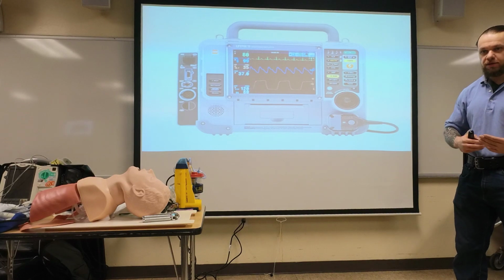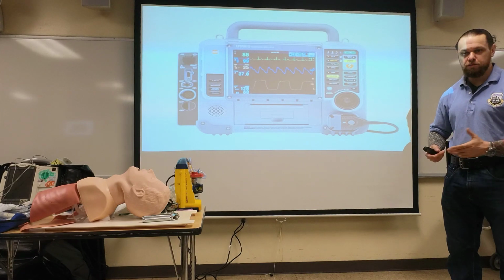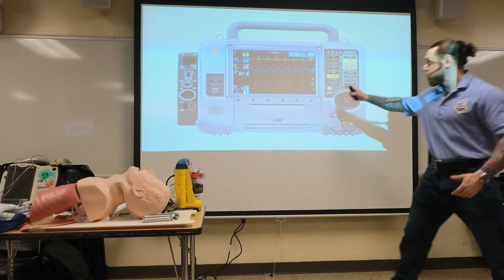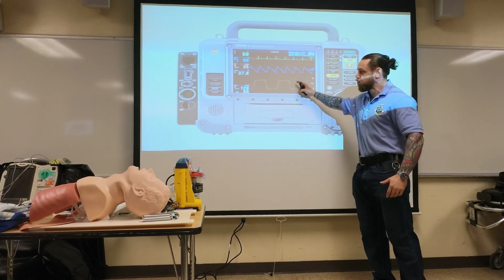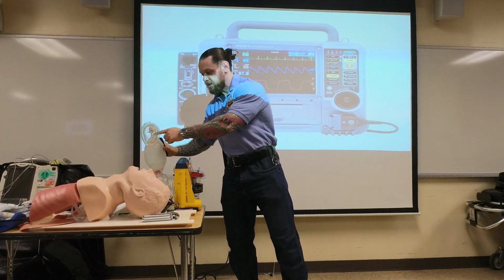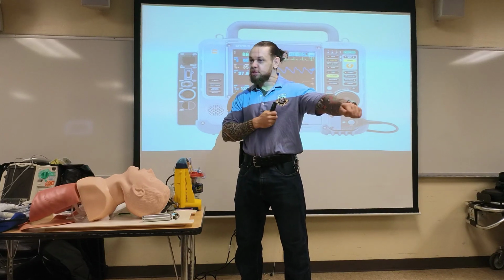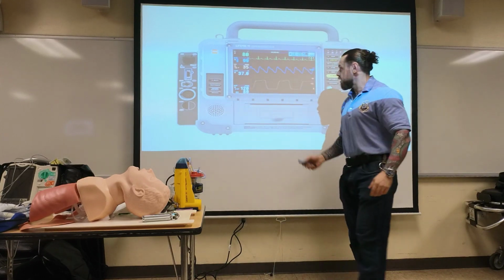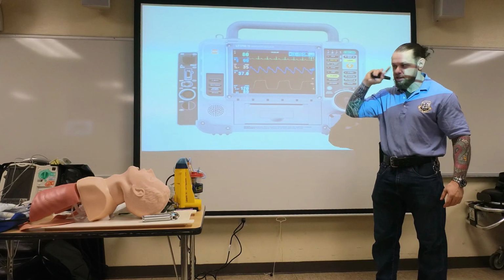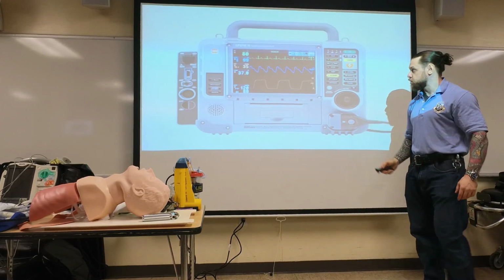And then as you assess that, let's say you determine it's a high priority patient. You want to intubate them, you're still bagging them, you move them to the ambulance, you're going to put them on your monitor. When I say put them on the monitor, you're going to put everything: your EKG leads, a pulse ox, and the end-tidal CO2, the one that he was holding in his mouth, between your mask and the BVM. You're going to put this monitor where you can see it, not turned to the side. And then I usually turn on the audible alarm, so I'm hearing and seeing, because if I start to hear my desats, I want to hear it. If I hear my heart rate elevate, I want to hear it. So put them on the monitor.